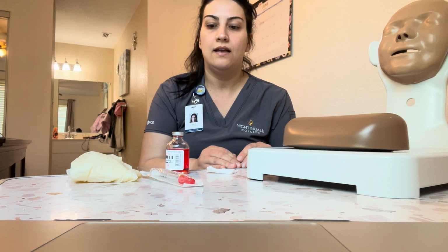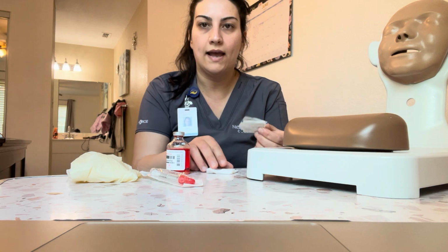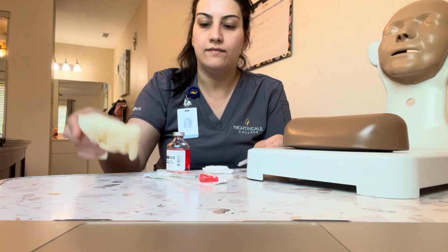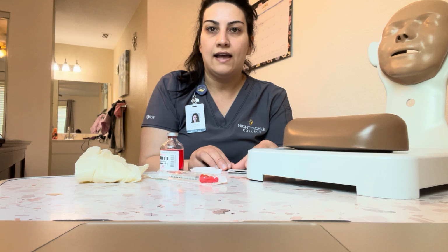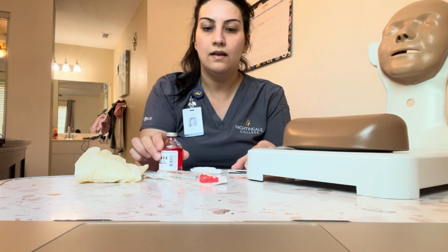I'm going to be performing the skills video of administering an intradermal injection. Supplies that are needed for this video are 2 alcohol wipes, a gauze, a syringe and needle, and a pair of gloves. Next, I'm going to verify the orders in the EHR against the MAR 3 times before giving any medication to my patient. So this is going to be the first time doing so.